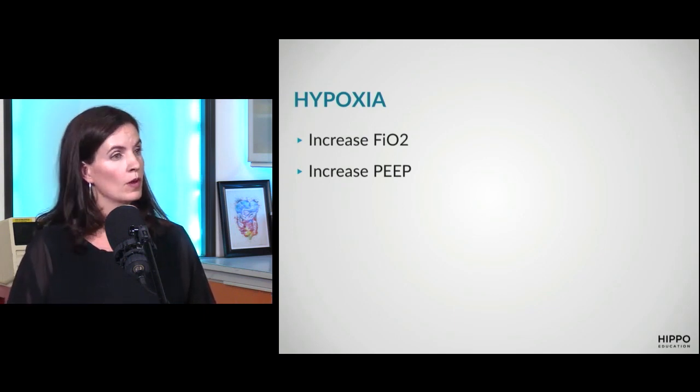Yeah, I like to think of the PEEP as like, if this is your alveoli and it's completely collapsed, there's no air in there for the oxygen exchange. If you've got that PEEP, you're just keeping that little grape open. And so there's always oxygen, so you're going to increase just that movement of oxygen across that membrane. Exactly. And in fact, allowing the alveoli to fully close and rub against each other is harmful to them. So we always want them to be open a little bit, even on a physiologic basis as well as an oxygenation basis.